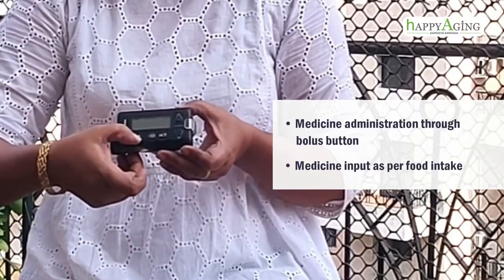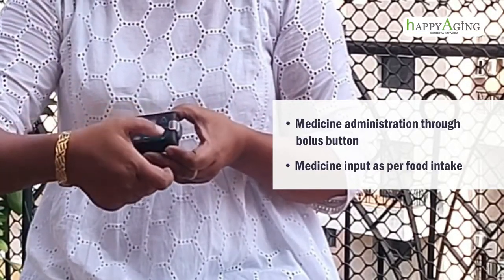Now I will talk about giving the medicine. It is very simple — you just have to press this bolus button and give the medicine as per your food intake. It is also very simple to stop the medicine — just remove the pump from the body. It is very user friendly. If you are going for swimming or taking a bath, you just have to remove the pump for that time.